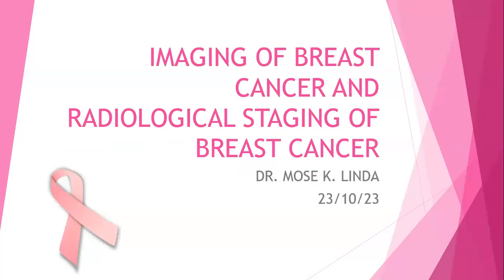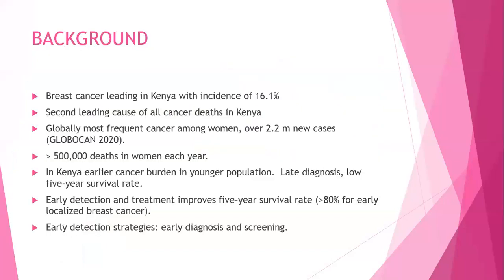Mamai. So our topic of discussion today is imaging in breast cancer and radiological staging of breast cancer. Just a brief background. We had a very good lecture last week. There was a series of presentations which again touched on the diagnosis of breast cancer and management, where a lot of information was again tackled. So my focus today will be on the imaging modalities that we have that aid us in the screening and diagnosis of breast cancer and the staging. Mammography was tackled to a large extent last week, so we'll do just a brief mention today.